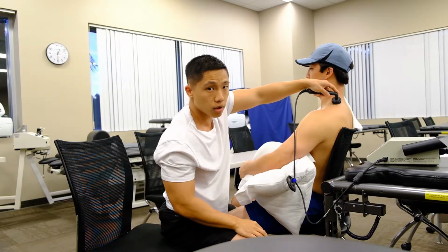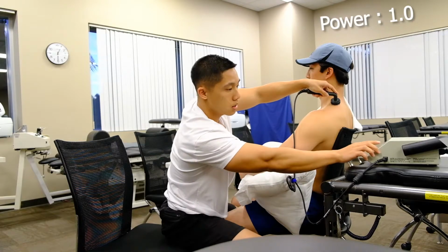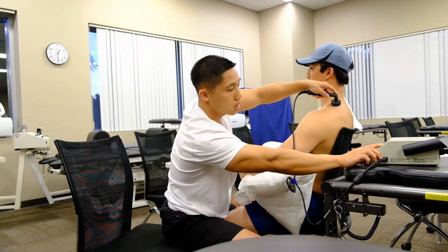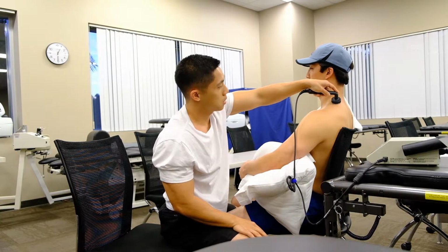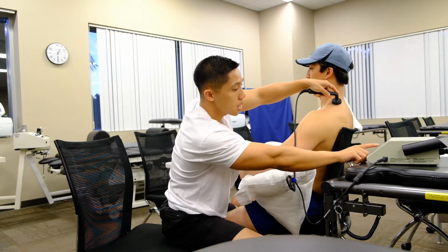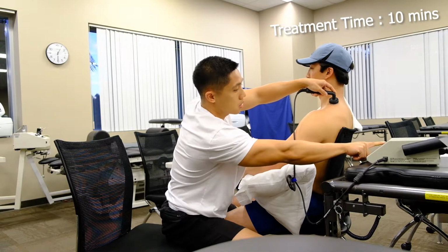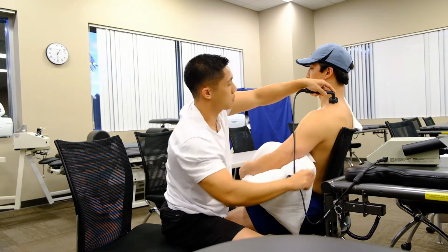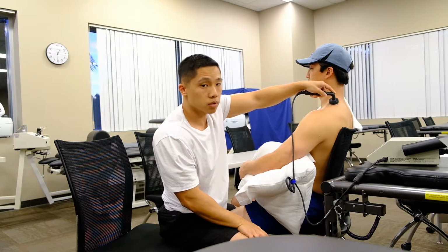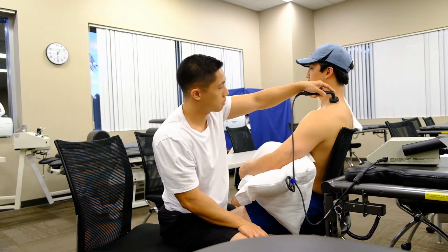And at this point I'm going to ramp up the intensity to 1, also within the subacute parameter. And then for this point, I'll go ahead and set the time to 10 minutes. You're doing okay? Yes. Excellent. So we're going to proceed with this modality for the next 10 minutes.